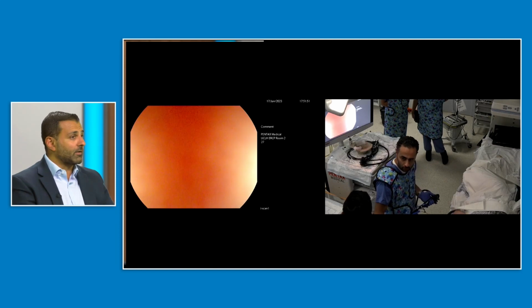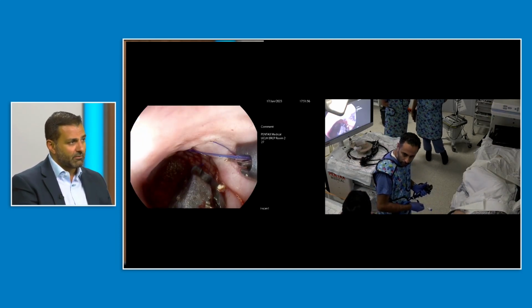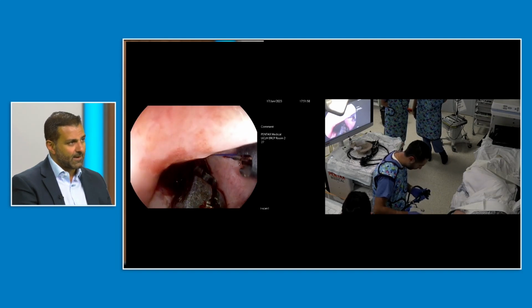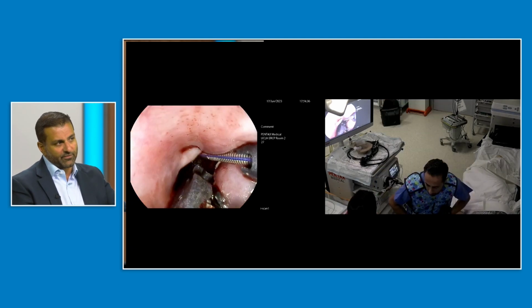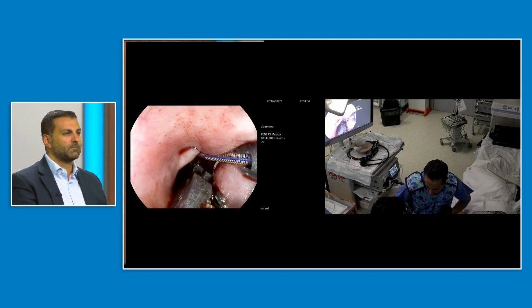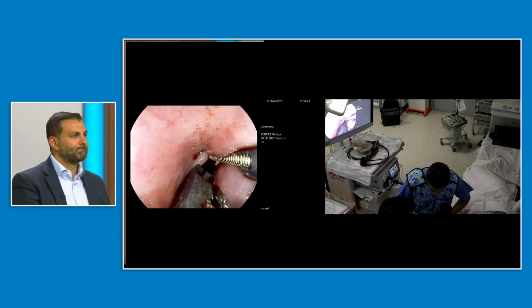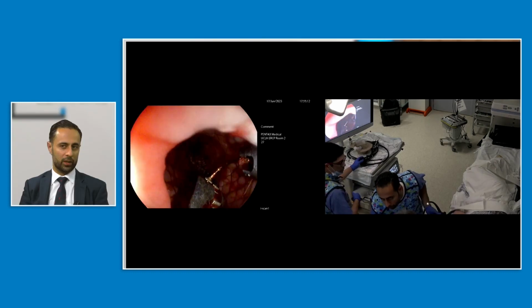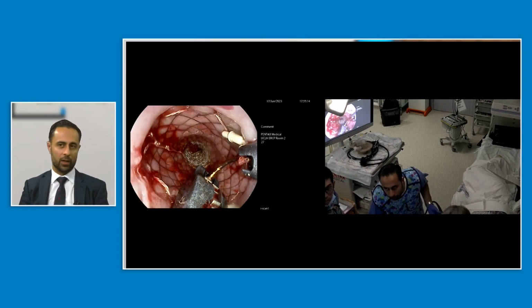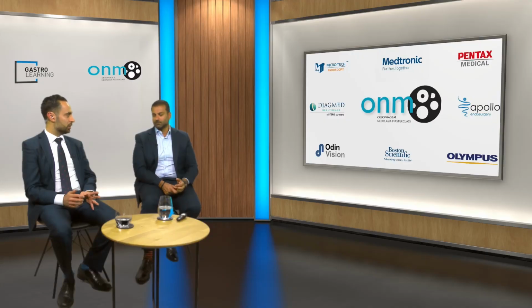Yeah. So look, another really nice demonstration here of using the device, and the stent will not migrate. Yeah, and we usually leave them in for 8 to 12 weeks, and we use the endoscopic scissors when we bring them back to very quickly cut the sutures. That's a lot simpler to do than sometimes removing the stent fix device, which is a little bit more clunky to remove with a specialized cutting kit. So there's something to think about moving forward.